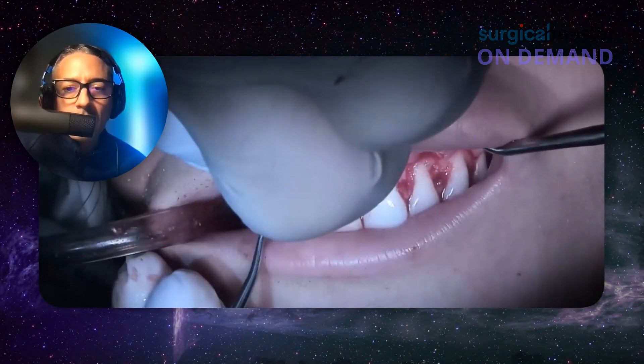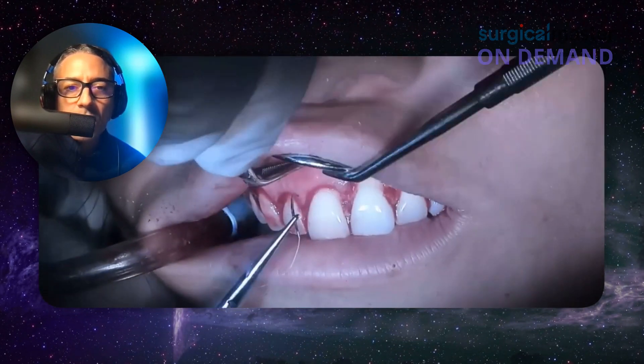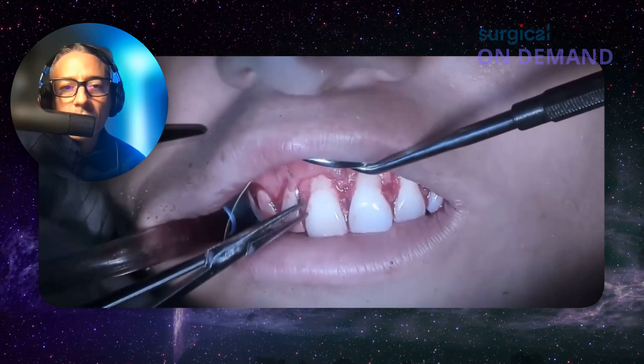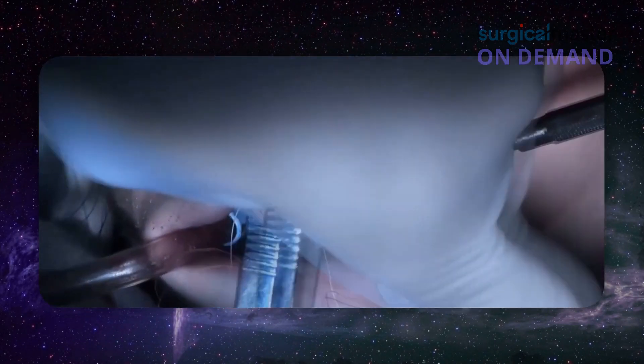You want to keep things nice and clean. So I first of all suture away from the tear. I engage the papilla — the middle of the papilla. You don't have to do it as a one shot. Let's call it the surgical papilla, which is part of the flap.